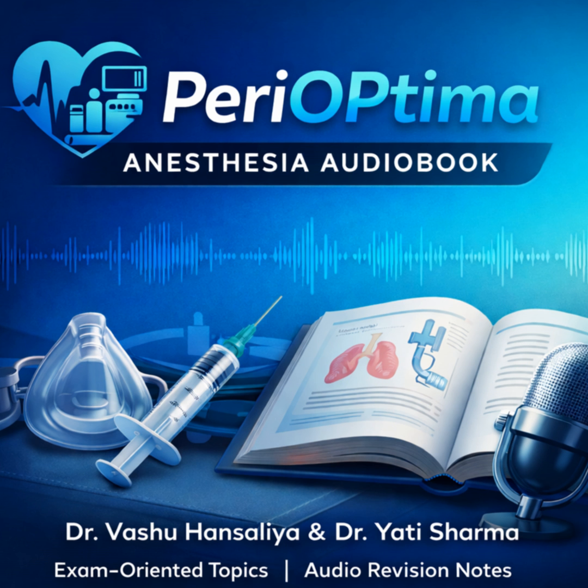So it's a stop sign, not a go sign. I like that, yes. Now, moving to respiratory monitoring, we mentioned SpO2 has a lag. The solution is capnography. This is high yield. I'm putting a star next to this.